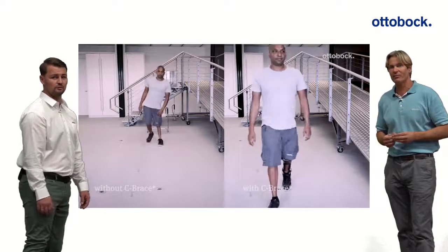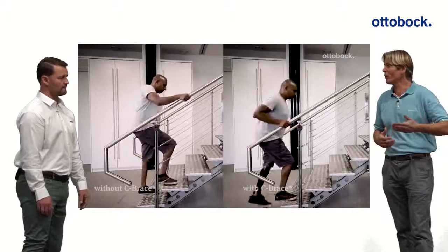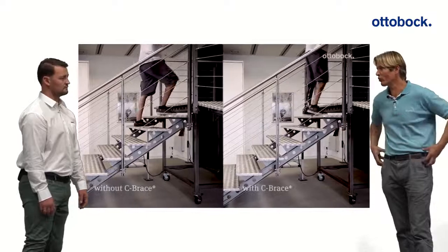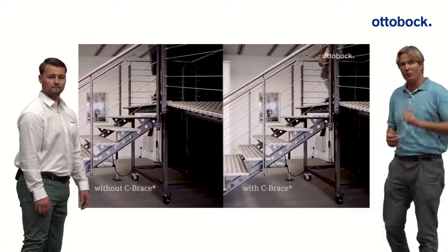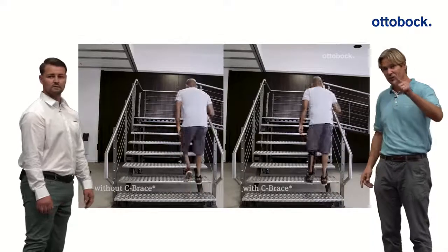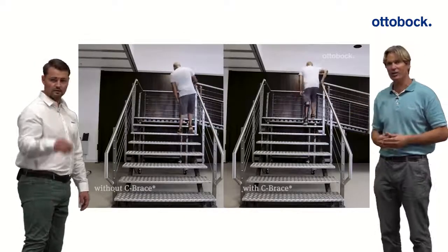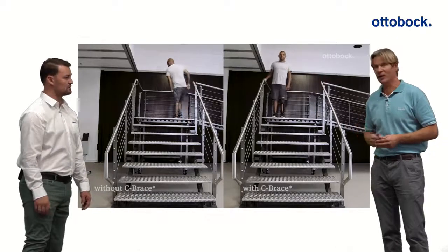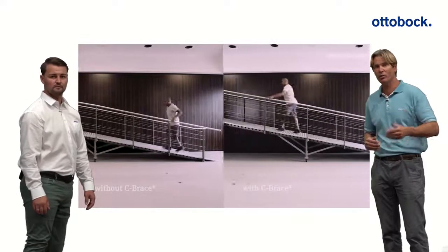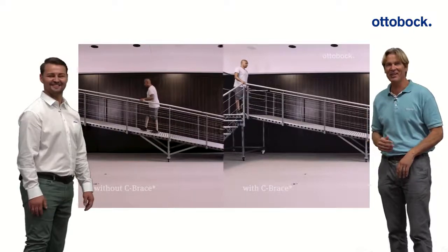In the video you can see his walking speed, and how he uses his hand to push his leg back for security — which isn't ideal, but he manages. He uses his upper body to fulfill the gait because his hip flexion muscles are not strong. He has a little side movement due to the polio affecting his abductors. Walking upstairs is different from Denise — he has to drag his leg because his hip extension is limited. But when upgraded to the Tango joint, he immediately said, 'Oh, I get that push to help me to the next stair.' You can see that little bounce when he comes off the stairs.